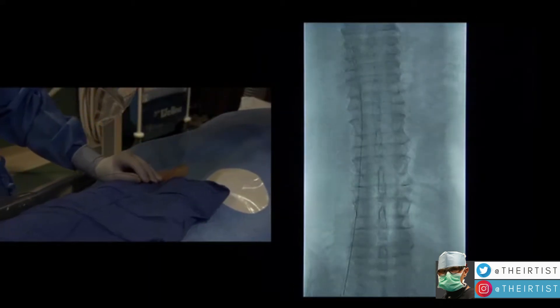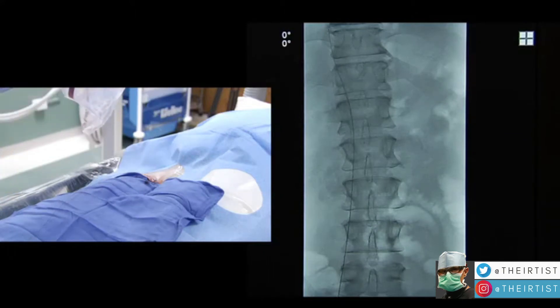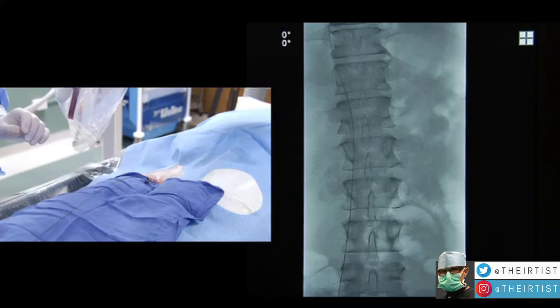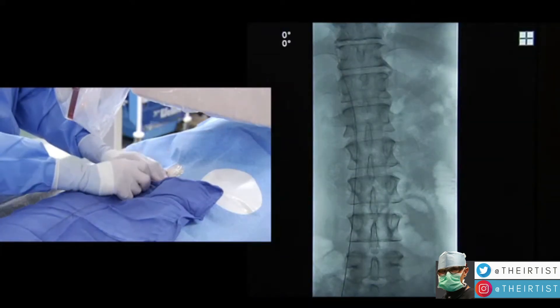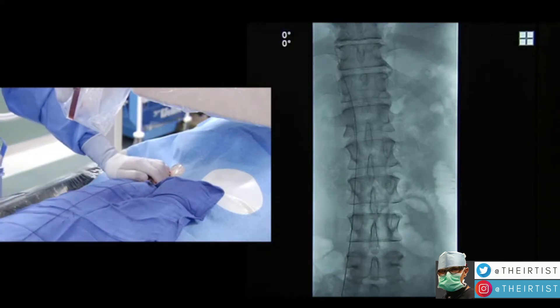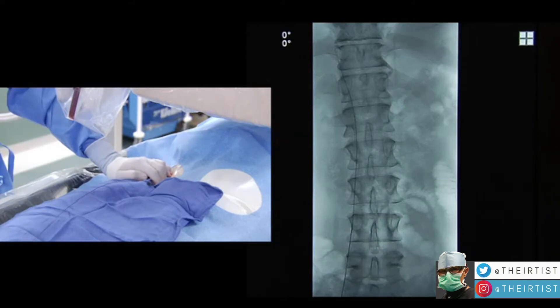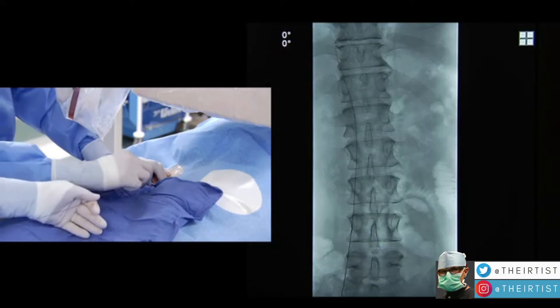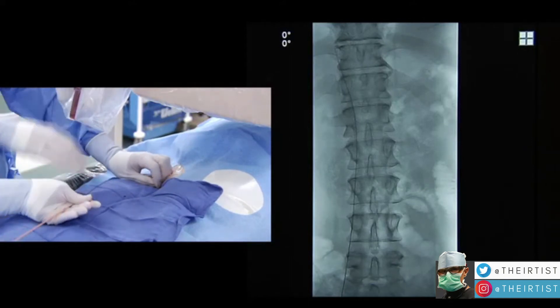Once access to the vein is gained, the physician introduces a small wire that is visualized on the right-hand screen. This is the beauty of interventional radiology — it allows the physician, specially trained in interventional procedures, to see inside the human body without the need to dissect or open it, allowing the patient to recover faster and with fewer risks.